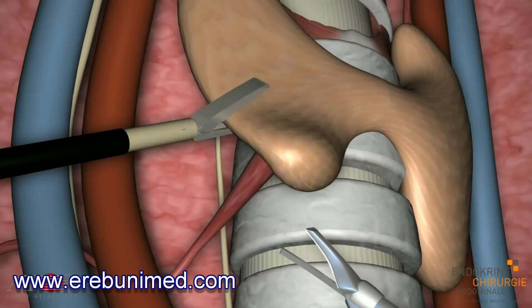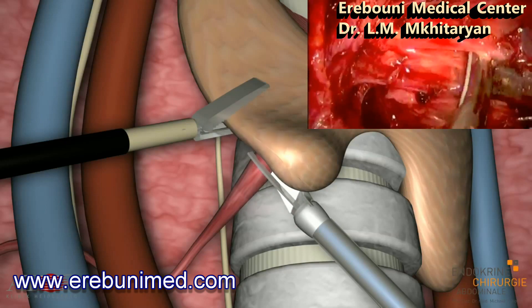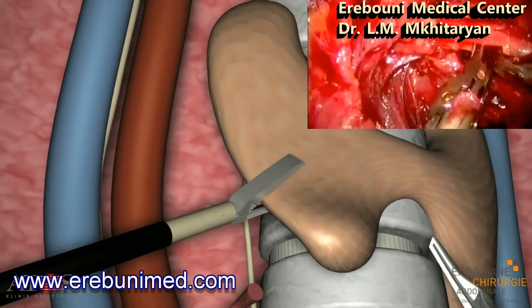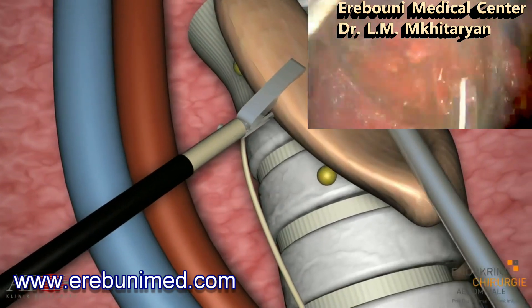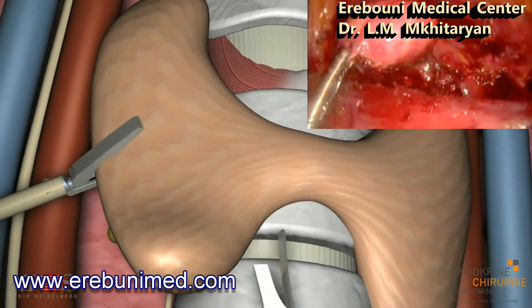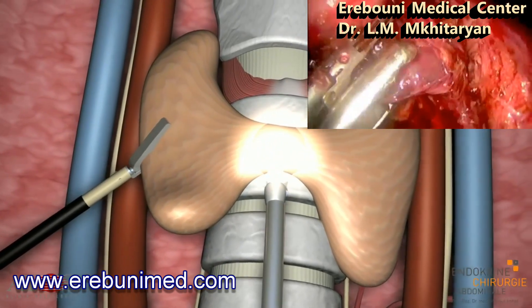The ultrasonic shear is used to divide the thyroid pole vessels, so no conventional stitches are required. The parathyroids are then separated from the thyroid — they are not removed from the body and continue to function perfectly after the operation. This is followed by a resection of either the entire thyroid or half of it using the ultrasonic shear.